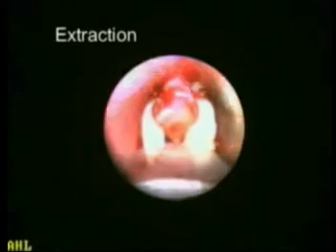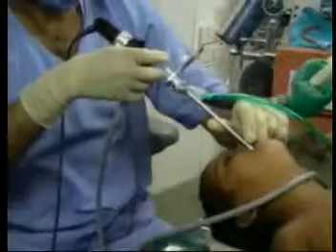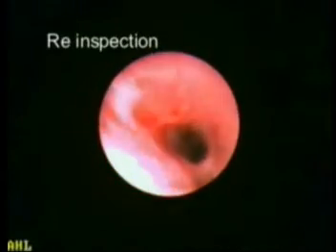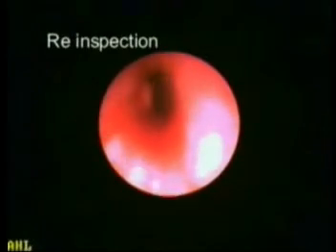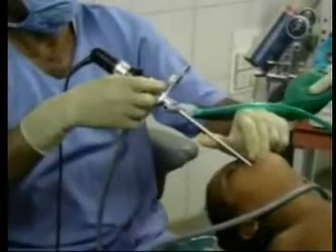The endoscopic camera shows the foreign body — a ground nut — grasped beyond the granulations and removed as one unit along with the scope. After removal, the telescope is passed again to re-inspect for any additional foreign body or pieces left behind, and to check for bleeding from the impaction site. In this case, granulations are seen at the site of impaction. The telescope is then withdrawn.